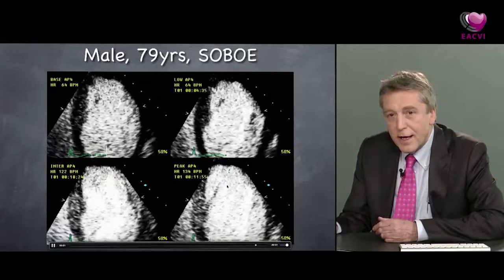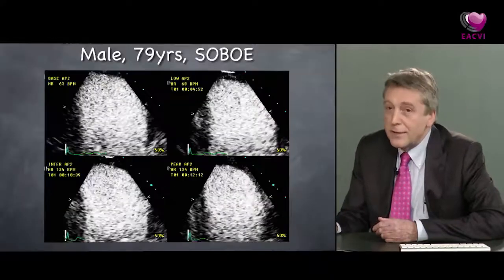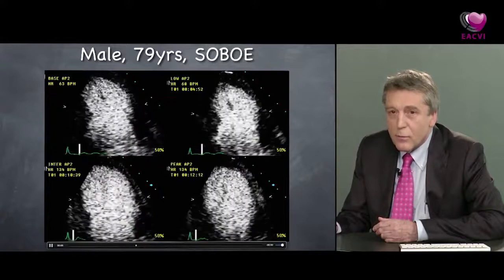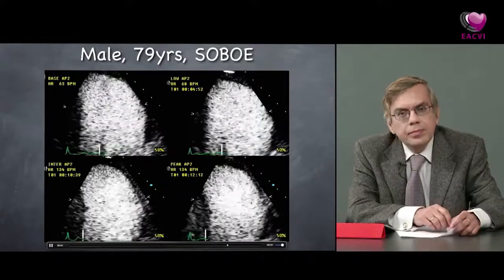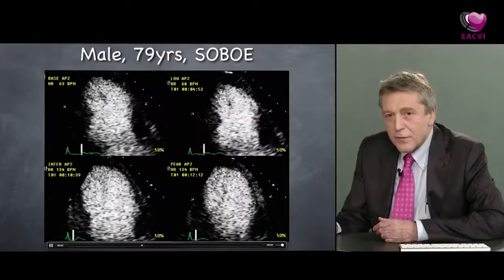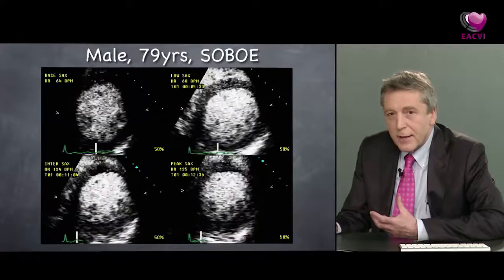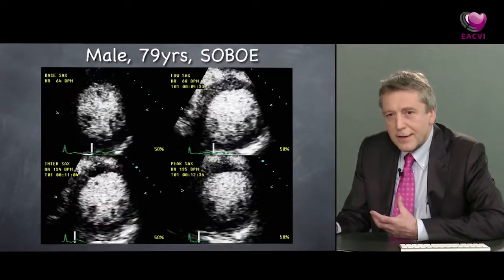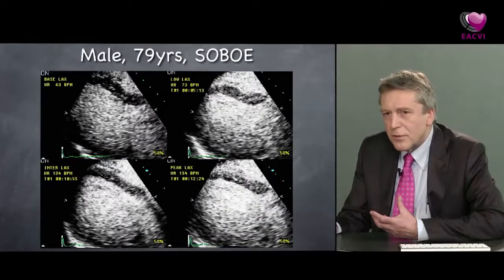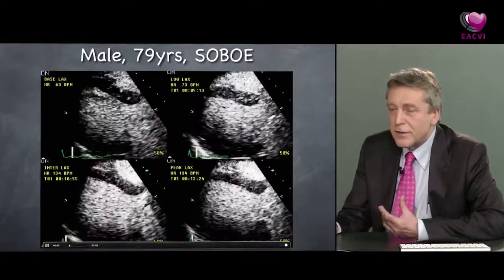It's replicated in all the other images as well. I know why people thought it was LAD disease, because you can see, and this may well be more severe, it may actually be left main, that there's really, really widespread wall motion abnormality up there in the anterior wall. And again, when you look at the short axis view, the cavity certainly hasn't got smaller and probably has got a bit bigger. Perhaps slightly less clearly seen in this long axis view, but again, this is a very, very abnormal response. All the myocardial segments are contracting poorly and the cavity has failed to decrease in volume.